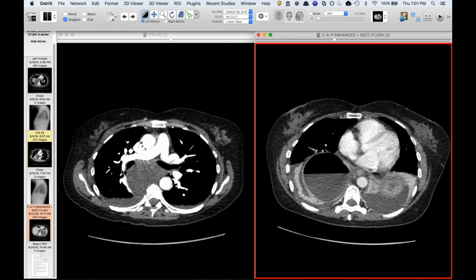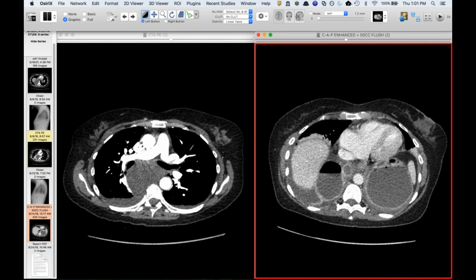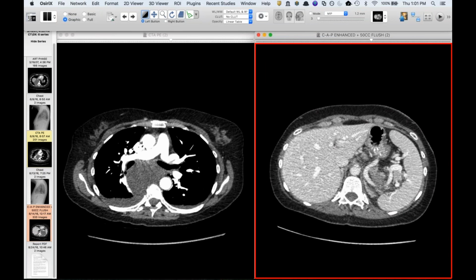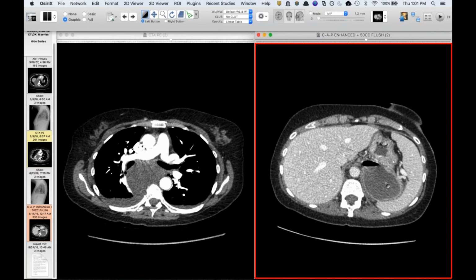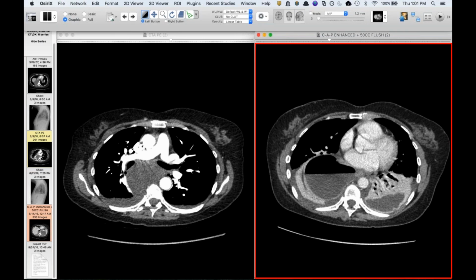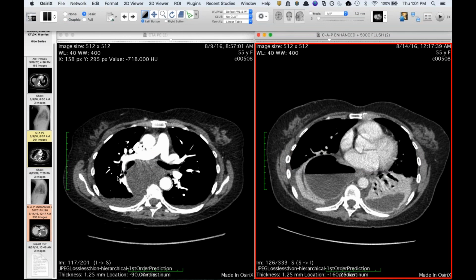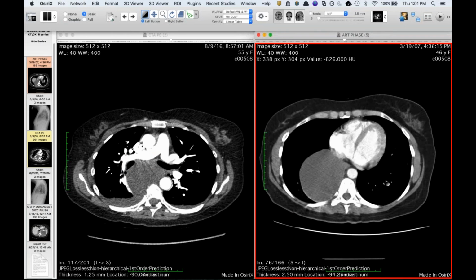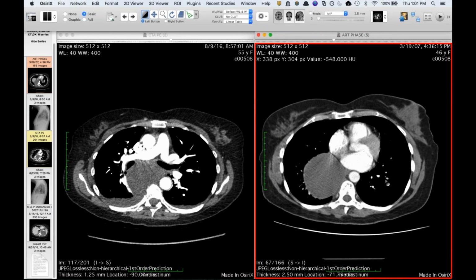Right. And the big pancreatic pseudocysts in the mediastinum should not contain air, unless they get infected or communicate somehow with the esophagus. I don't know. But Travis, how old is this person? She's in her 50s, I believe. Let's see. 55. Yeah. So she was in her 40s when this was just apparently discovered incidentally back in 2007. Wow. I don't know. All right. But it's gone.